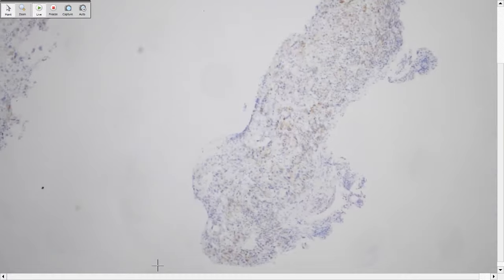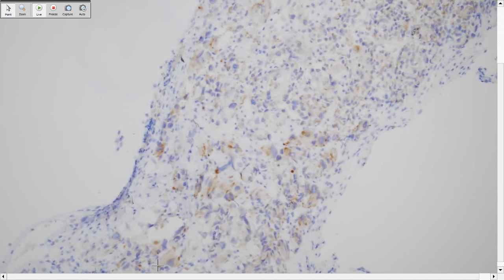If you see prostate, even your first diagnosis probably came from a bladder biopsy. Whenever you see, oh my gosh, this one does not look like a conventional urothelial carcinoma, think about maybe high-grade prostate adenocarcinoma in there. I think I have several cases. If it were a low-grade 3+3, you could probably think it's glandular and you have a colon mass or prostate.